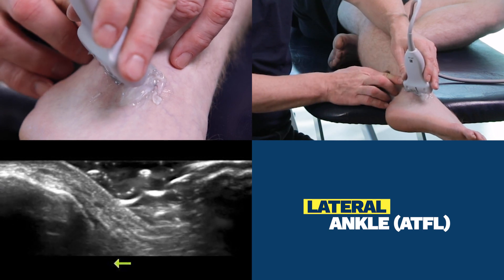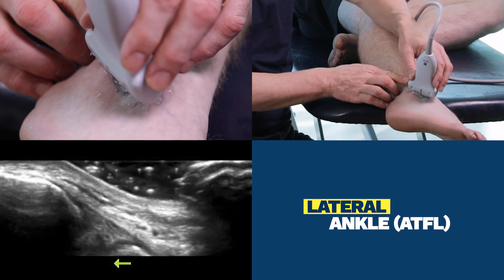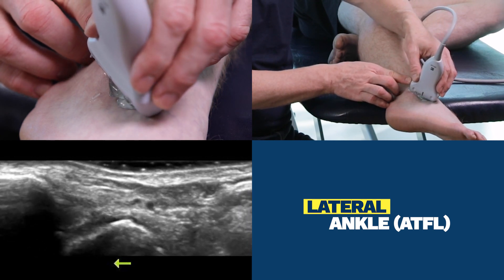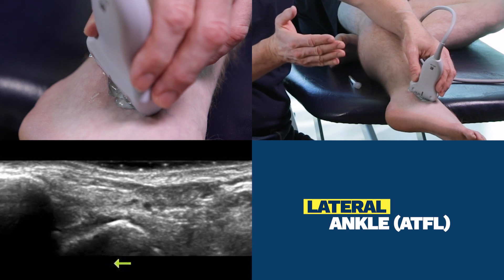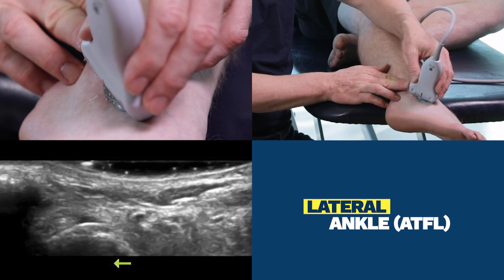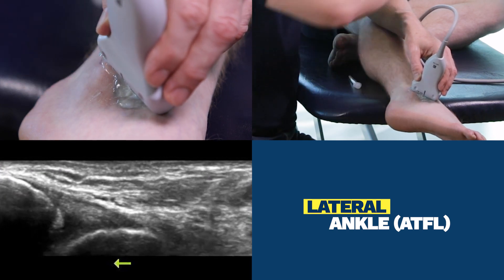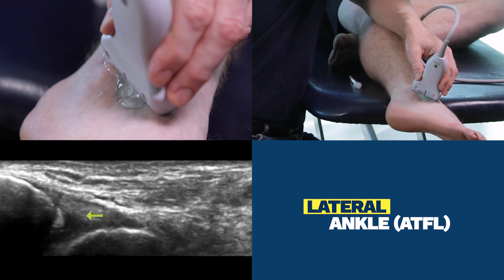The movement of the probe is simply going to be to bring the far end of the probe onto the foot and then make a slight motion up or down until the ATFL comes into view. We see it quite clearly here.